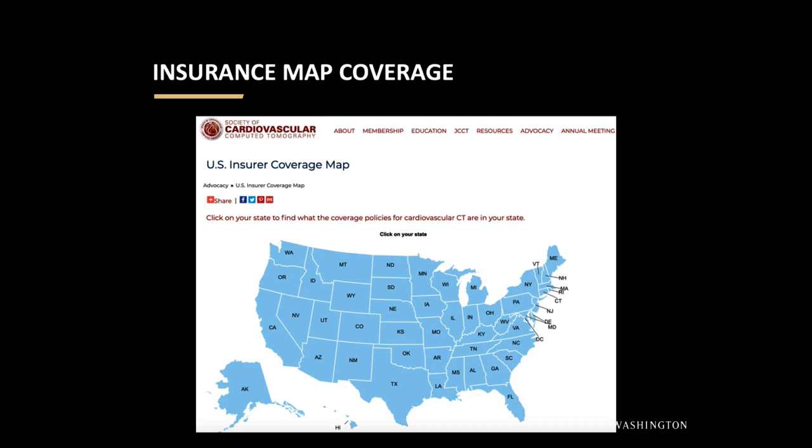Well, go ahead. This raises another interesting issue. We always have to rule it out. Functional and anatomical testing ask different questions entirely, and there's microvascular ischemia, small vessel disease, all that sort of thing. How do we use those tests in a more refined way? I mean, how do we choose between the two? So the CTA will not pick up microvascular disease most of the time in its current iteration. Yeah. But functional stress might. Yeah.